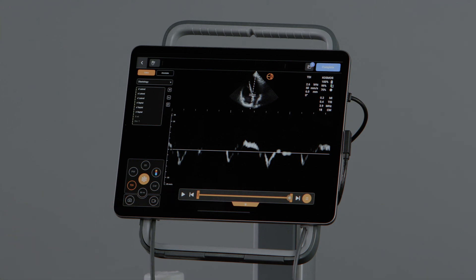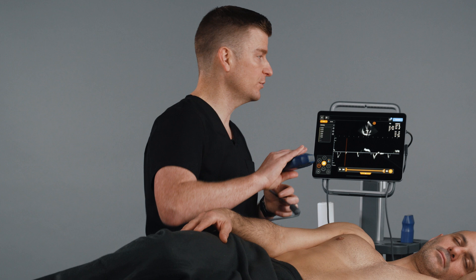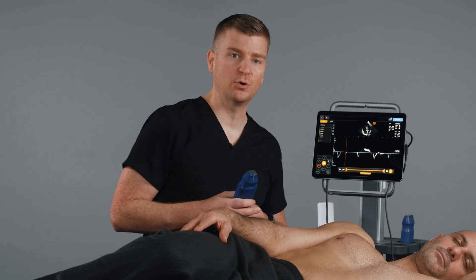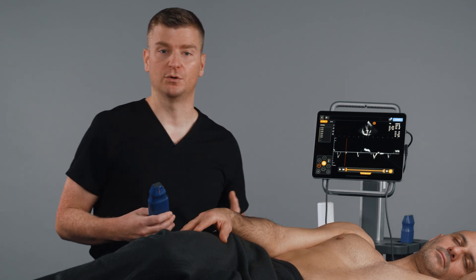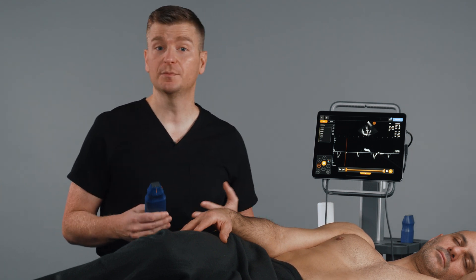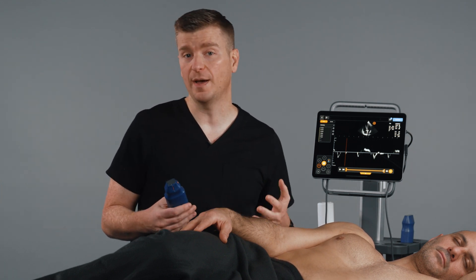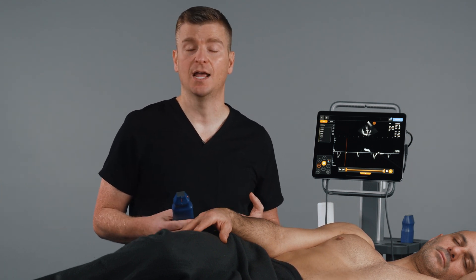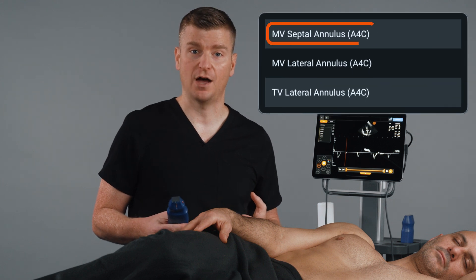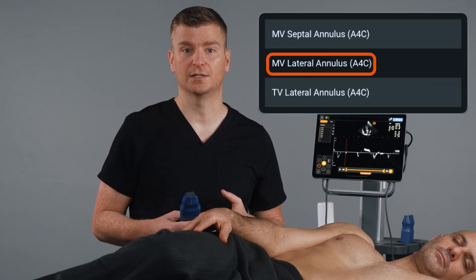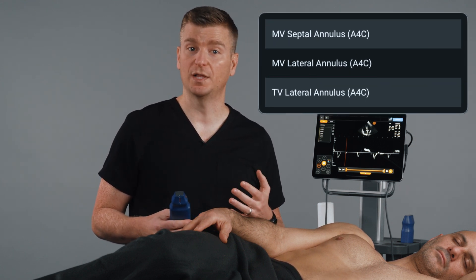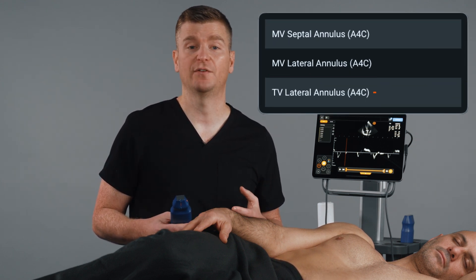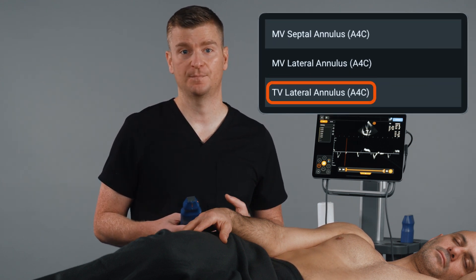Remember that if you're using autodoppler in the apical four-chamber view, the system can help you automatically place the TDI gate at the mitral valve septal and lateral annulus, as well as the tricuspid valve annulus.